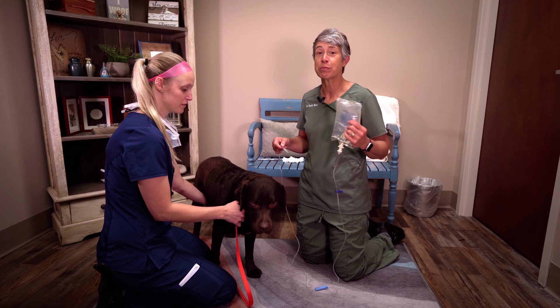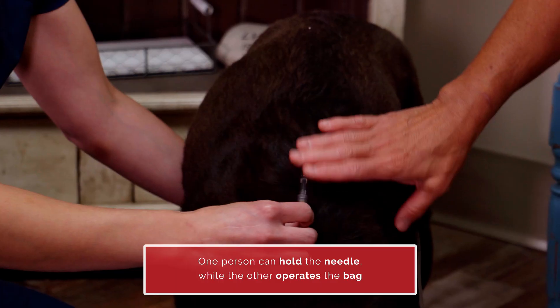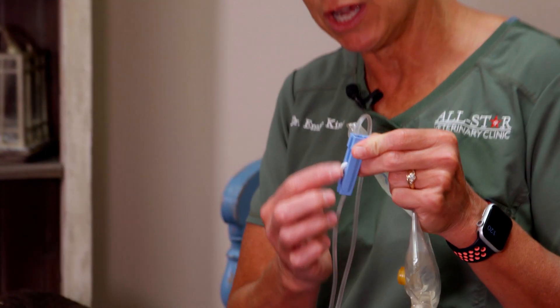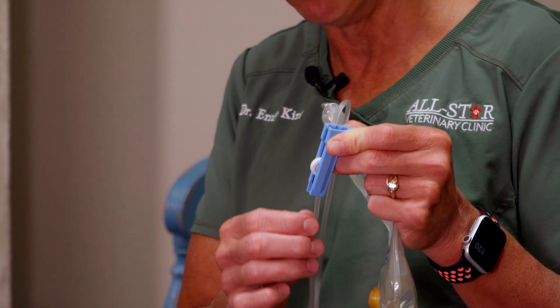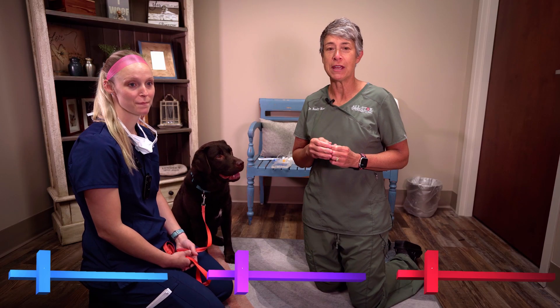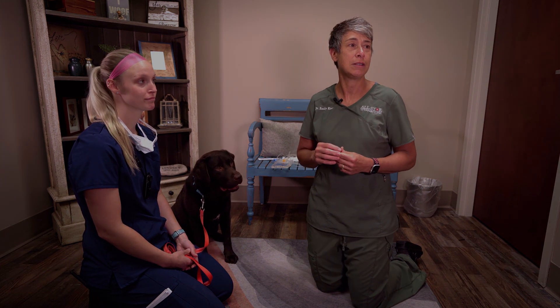When giving subcutaneous fluids, insert the needle as previously described, but it's really helpful to have somebody helping you so they can hold the needle in place — that way you've got both hands to operate the bag as well as the roller, which restricts and cuts off fluid flow. When giving fluids, you un-dial the roller to open up the line, then you can squeeze or roll the bag to speed up the process. If you need any further clarification on how to give subcutaneous injections, don't hesitate to reach out. We're always happy to help here at All-Star Veterinary Clinic.